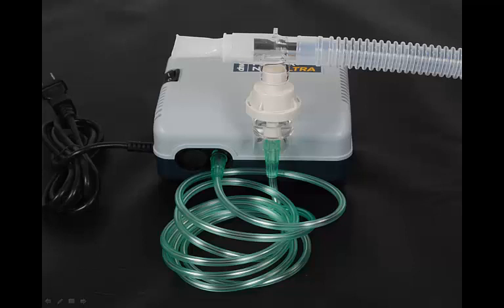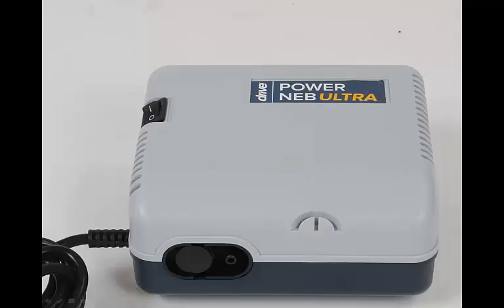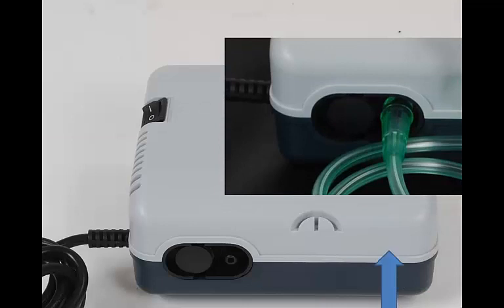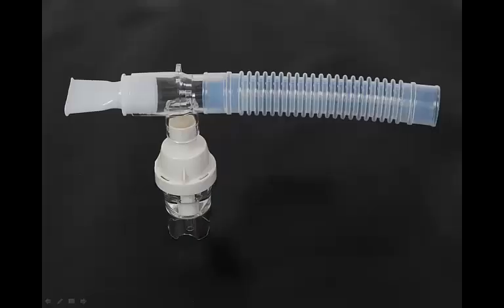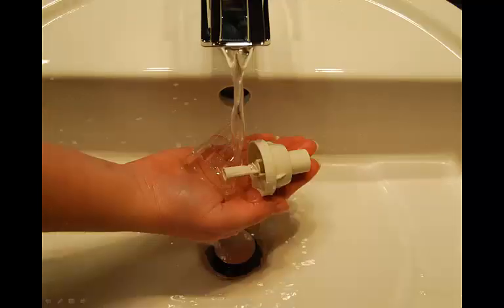Be sure the power switch is in the O position indicating the unit is turned off. Be sure the power nebulizer is unplugged from the electrical wall outlet. After each use, disconnect the tubing from the air outlet connector and set aside. Disassemble the mouthpiece from the cap. Turn the nebulizer cap counterclockwise to remove the nebulizer cup. Wash all items, except for the tubing, in a hot water and dishwashing detergent solution.